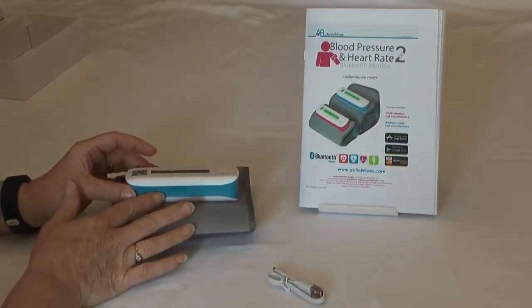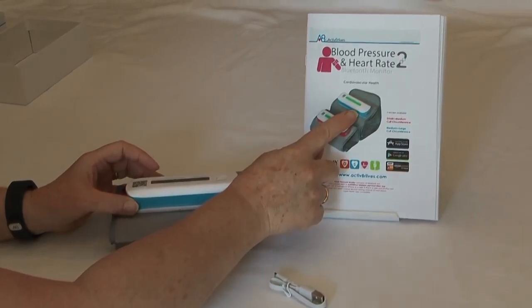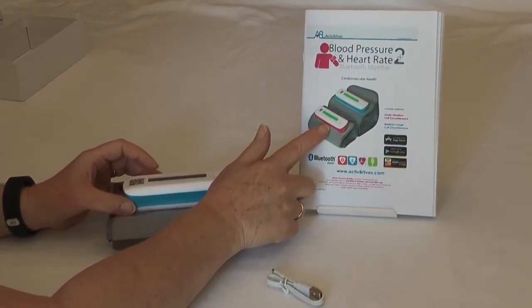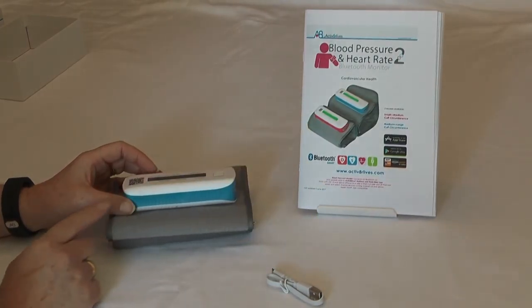The Blood Pressure 2 monitor comes in two sizes. There is the blue, which is a medium to large circumference upper arm, and the pink is a small to medium circumference of the upper arm.